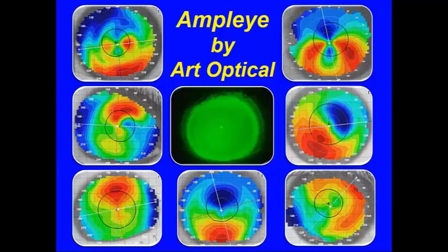Yep, and I know that we can adjust that up to 375 microns of toricity. So we do have a pretty good degree of range with that. Here's another question, and I know there's a lot of questions here, and we're going to have to sum this up fairly quickly, but I'm going to run one or two more questions by you, Patrick.